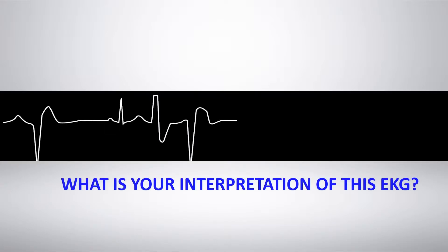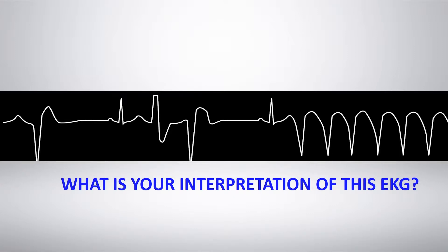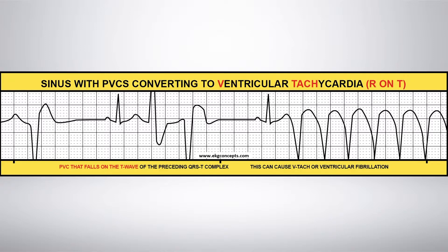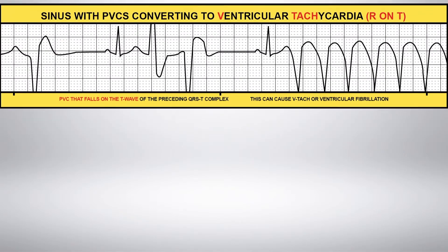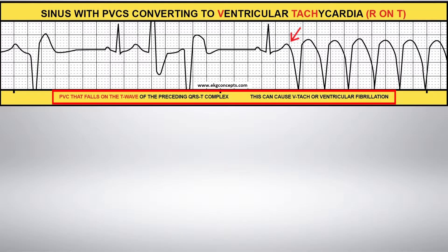What is your interpretation of this EKG rhythm strip? Sinus with PVCs converting to ventricular tachycardia, or R on T. With the R on T phenomenon, a PVC is interrupting the T wave of the preceding beat. This often leads to serious ventricular rhythms, such as VTAC or VFib.